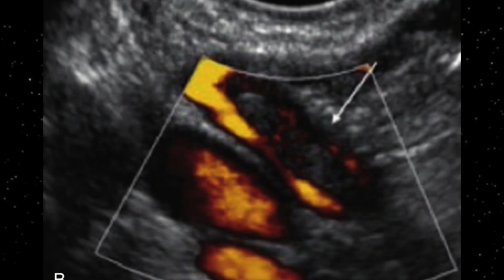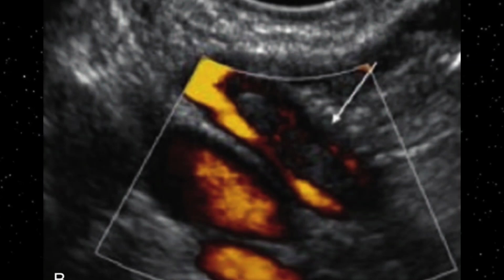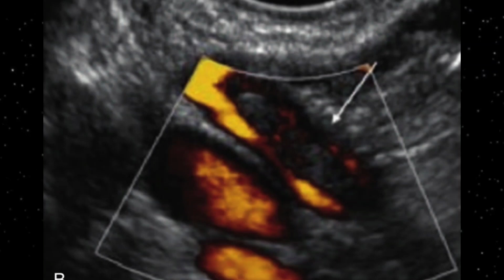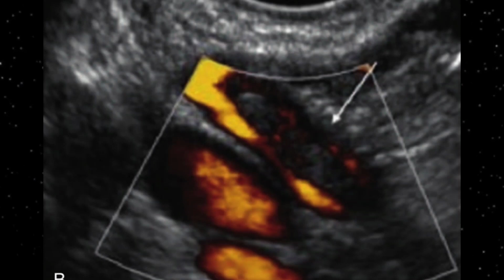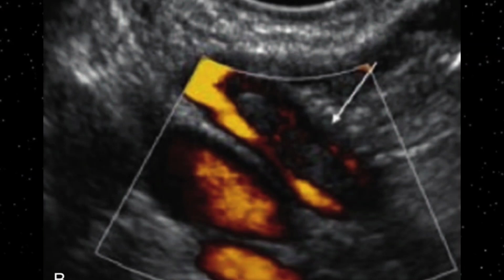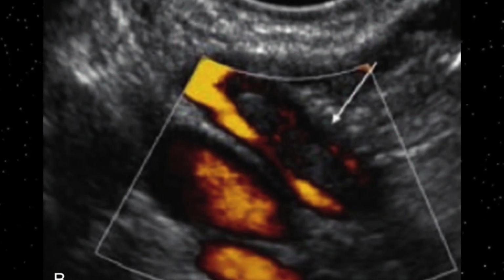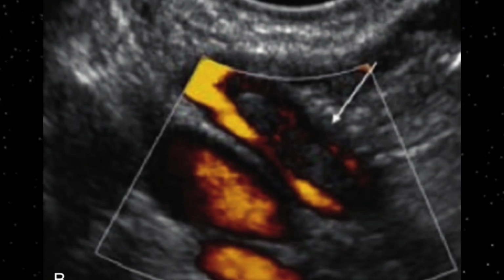So the ovarian vein is tortuously dilated, and it shows partial flow. Centrally it is blocked, as this echogenic thrombus is partially filling the ovarian vein lumen. Wherever you see the thrombus, it is important to use the Doppler signals, because Doppler is the one important modality to confirm whether there is any intravenous thrombosis or not.